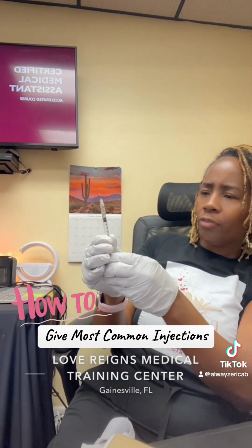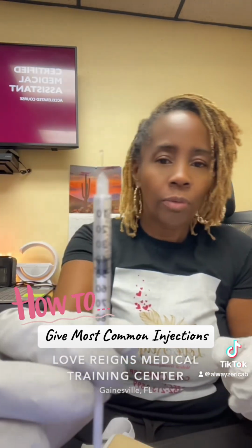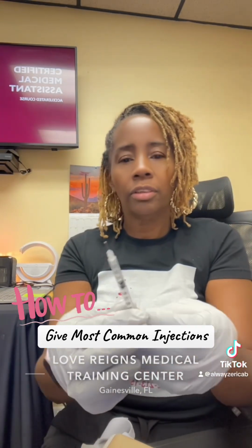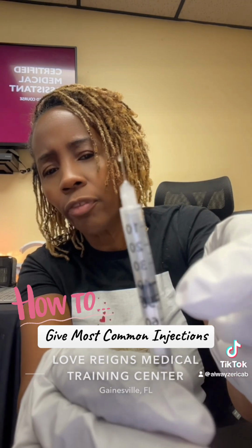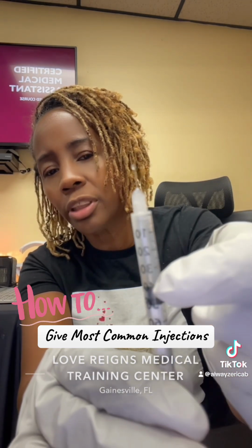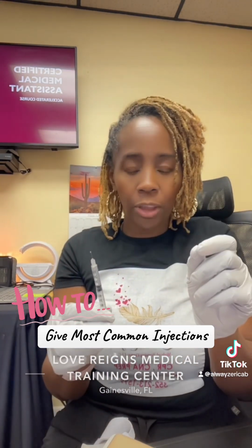And I'll push that up to 40, because if you give 42, that's a med error. So it needs to be 40. If the doctor says give 40 units, we're going to give 40 units, okay? So now I have exactly 40 units, and you can see the 10, 20, 30, 40, the top plunger part is on the line. That's the line that you're looking for as far as knowing the exact amount, okay?